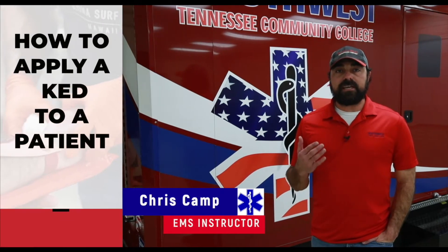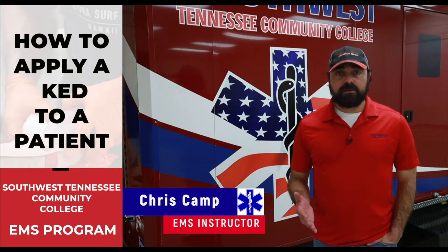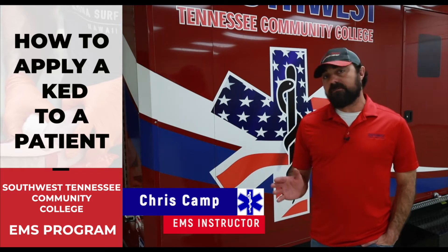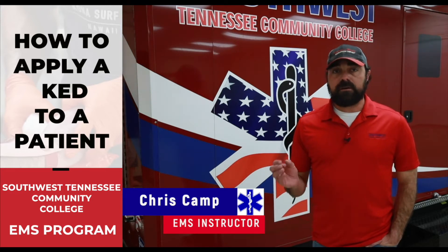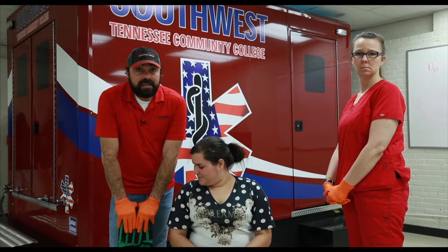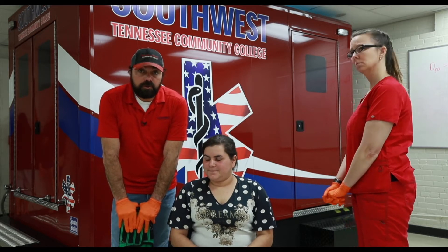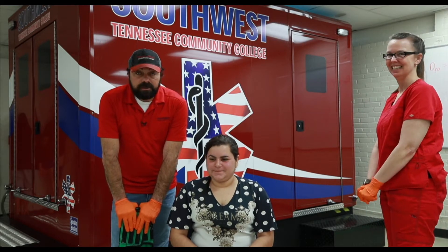This next skill is the Kendrick extrication device, also known as the KED. This is no longer one of your possible randoms, but it is still a skill and a piece of equipment that is out there. I will show you from start to finish, but we will not follow the National Register check sheet at this time. I'm just going to show you how to properly place this device on a person.